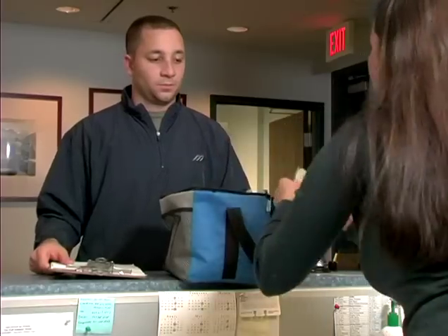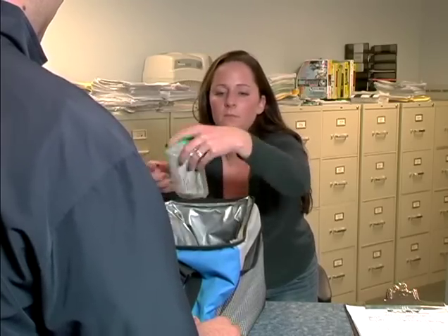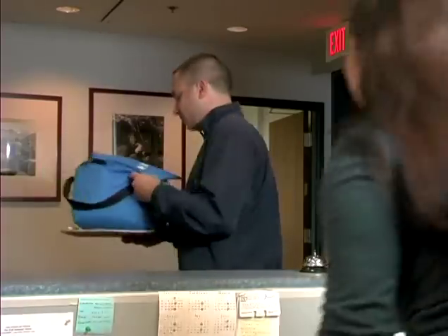To prepare the donor's specimen for shipment, place the sealed bag containing the CCF and specimen bottles in a sturdy shipping container and seal appropriately. More than one sealed specimen bag may be placed in the same shipping container, as long as they are going to the same laboratory.